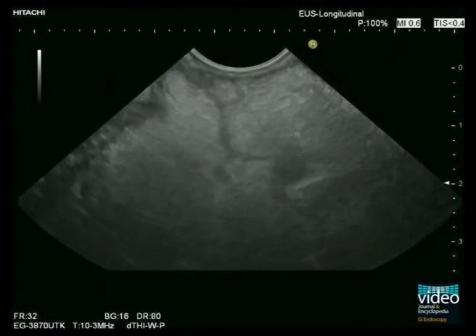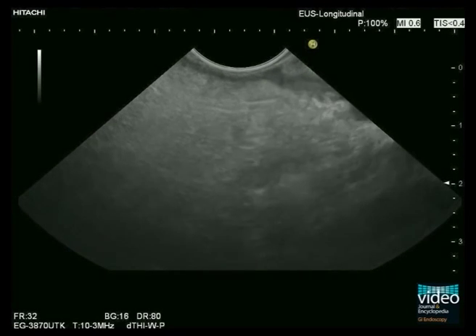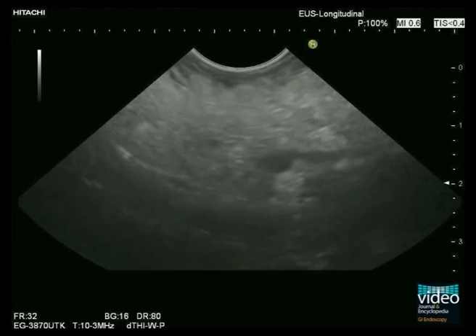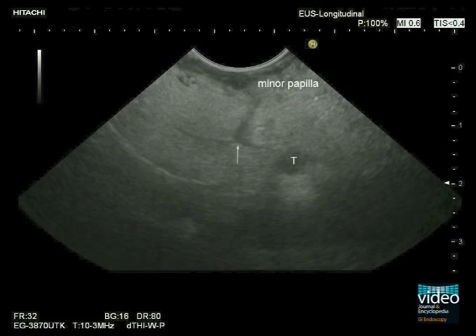In this 68-year-old lady with recurrent acute pancreatitis, an 8 mm hypoechoic seemingly solid lesion is visible in close contact to the main pancreatic duct. EUS-guided fine needle aspiration reveals IPMN of the gastric type. The solid appearance is simulated by hypoechoic mucus, which has caused the recurrent attacks of pancreatitis. The arrow points to the communication of the ventral and dorsal pancreatic ducts.